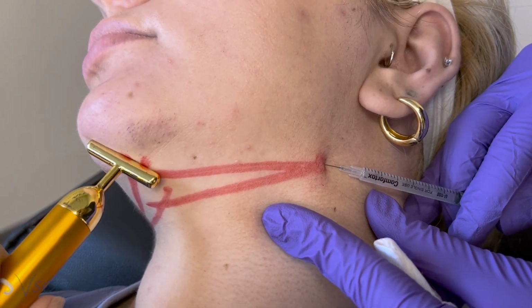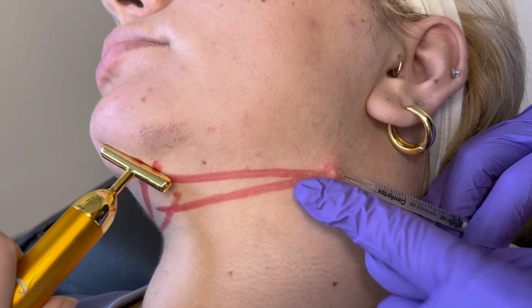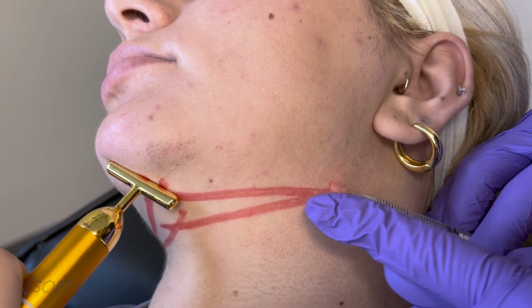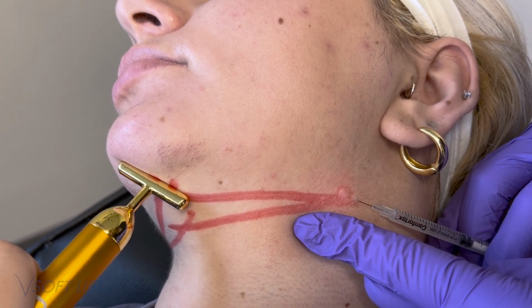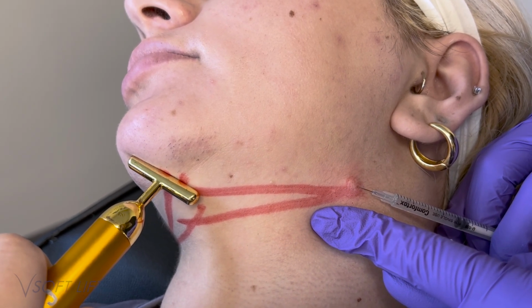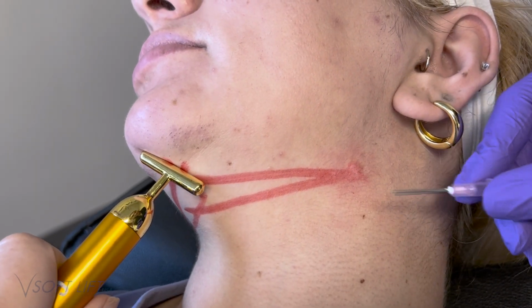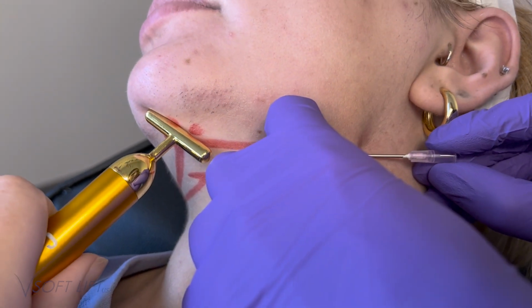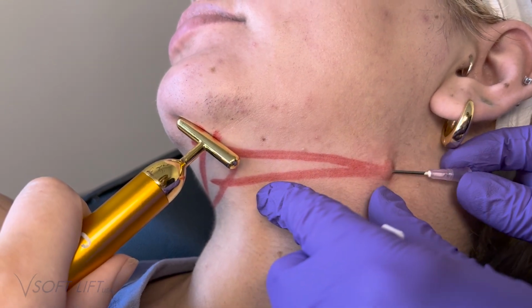With that being said, we opted for a filler treatment on top of neck threads. We have previously done filler treatments in her jawline and her chin. We were hoping to just keep working, and I told her it was going to take a while to build up that jawline and that she's got to give me a year and be patient. She was interested in trying threads for the first time at this appointment, so we opted for 2 neck threads bilaterally to snatch the jawline from a different angle while continuing to work on that gonial angle in the back of ramus filler injection points.